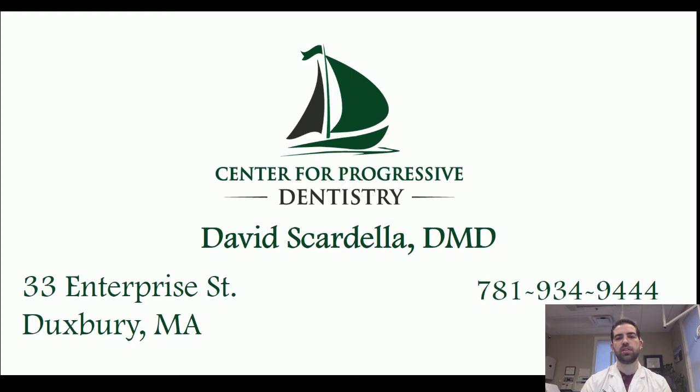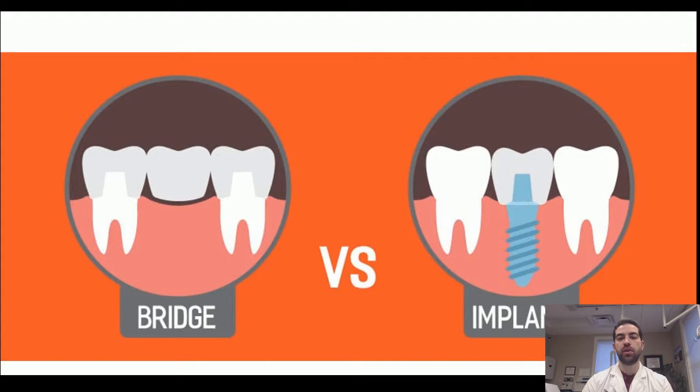During this quick dental consult, I wanted to go over the differences, advantages, and disadvantages between dental implants and dental bridges. This very simple cartoon summarizes the major differences. On the left, the dental bridge is retained by the adjacent teeth, whereas on the right, the dental implant stands alone and is not connected to those adjacent teeth. Both options are fixed, meaning they're cemented or screwed in, and they cannot be removed by the patient.